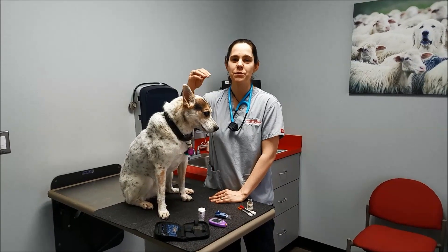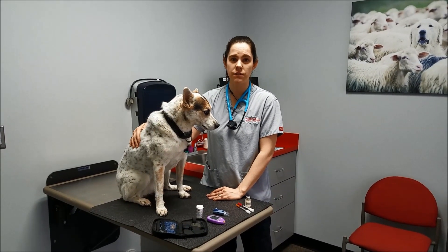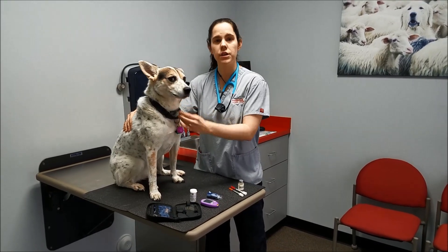Hi, my name is Allison. Welcome to Pikesville Animal Hospital's client education videos. Today we're going to be doing an insulin demo.